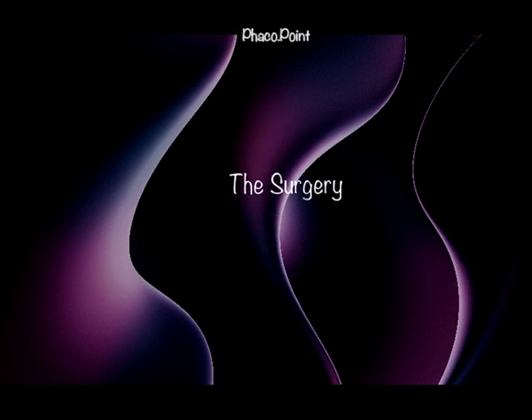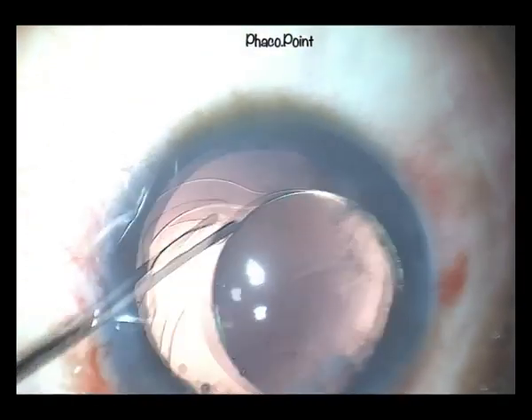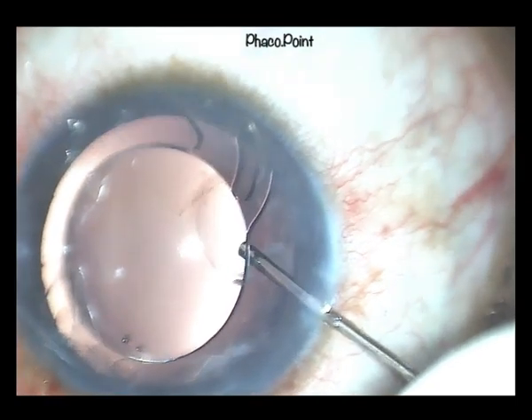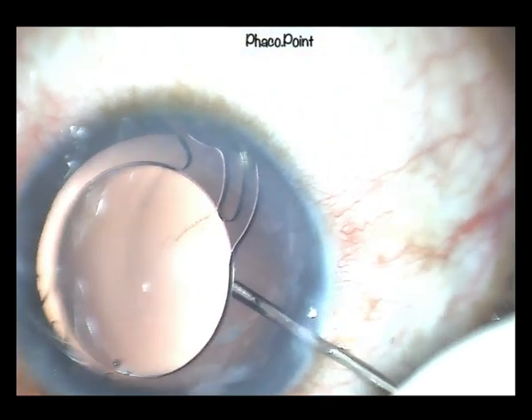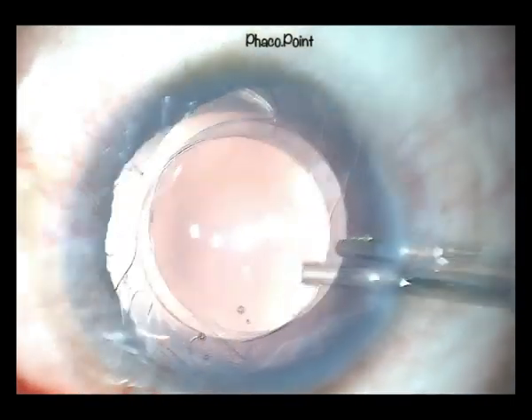Moving to the IOL explantation surgery itself: under adequate viscoelastic cover, the surgeon uses either a Sinski hook or a Kuglin hook and rotates the IOL into the anterior chamber. Adequate viscoelastic is placed both behind it to push the posterior capsule away, as well as above it to protect the endothelium.